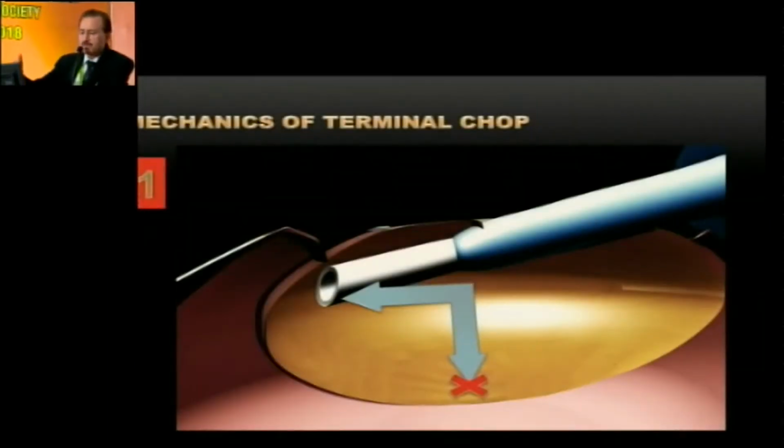So the most important step in this technique is the position of the phaco probe. You can see the phaco probe has to be superficial, and it has to hold the nucleus at the equator.